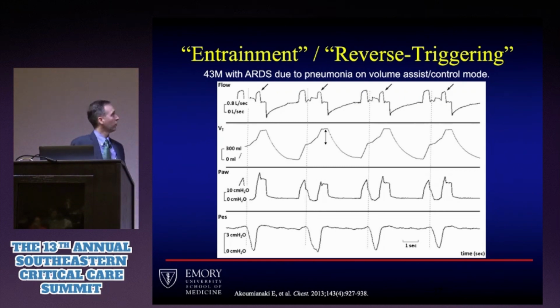So there's another form of triggering that is called reverse triggering. This is a different phenomenon that I wanted to bring up because I feel like I see it every about 2 weeks when I'm on ICU service, and it's from entrainment or reverse triggering. These are the same thing, but they're called different names in the literature. It was originally described in patients with ARDS, but it's been more described in patients with severe sort of brain suppression, either through a brain injury or through sedation.